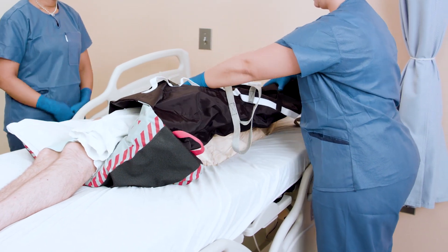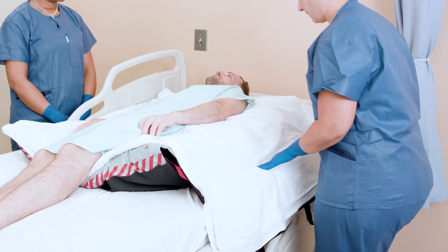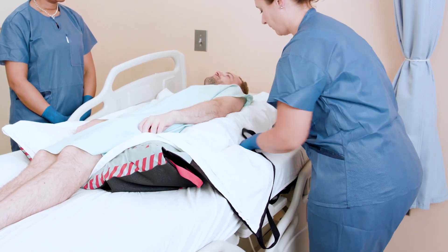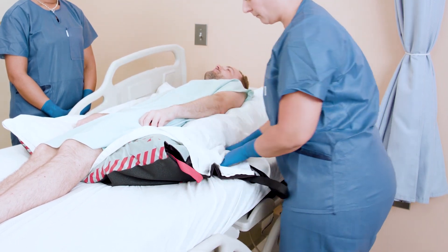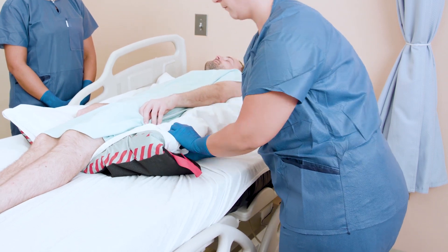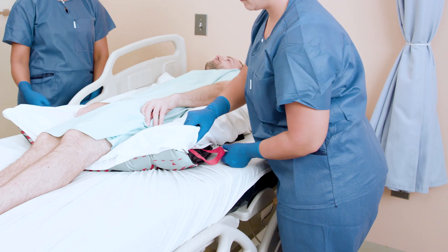The fluidized positioner lets the clinician dictate the degree of turn. If the patient cannot tolerate a full turn, a smaller micro turn could be achieved instead, and the fluidized positioner will maintain that position. Tightly tuck the draw sheet and tortoise pad under the positioner to secure it in place.